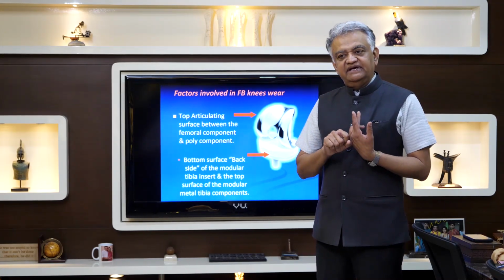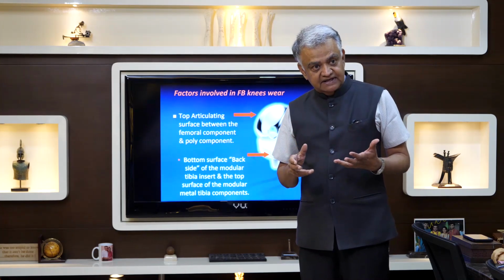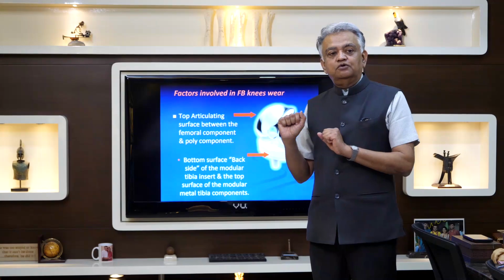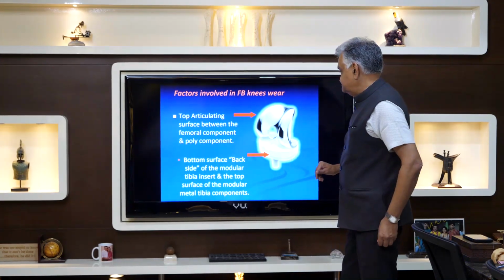So backside wear can be avoided or minimized by virtue of the nature of the metal you select, the locking mechanism, and the plastic. And that we'll talk about in a moment. The nature, or the characteristics, of the plastic itself, the insert itself.